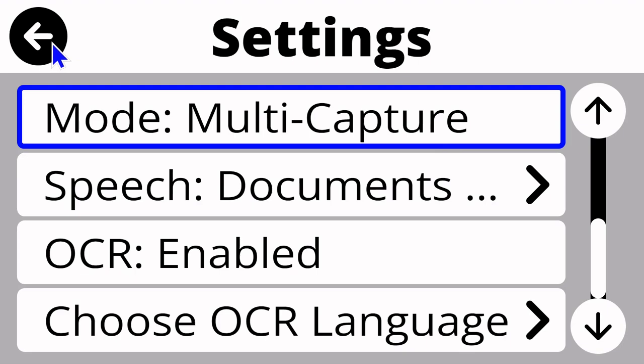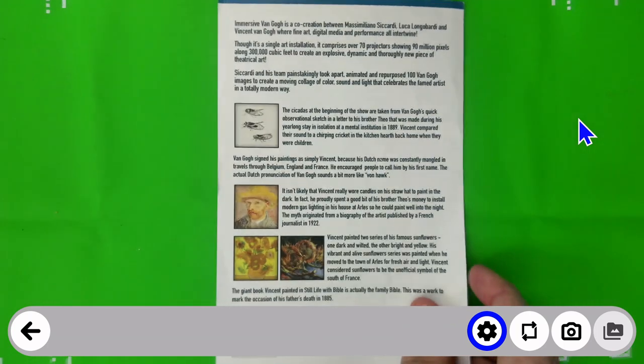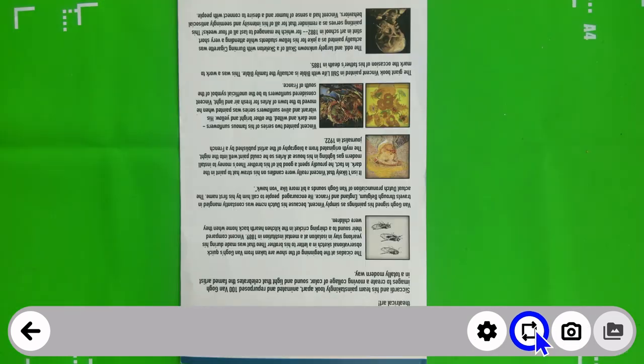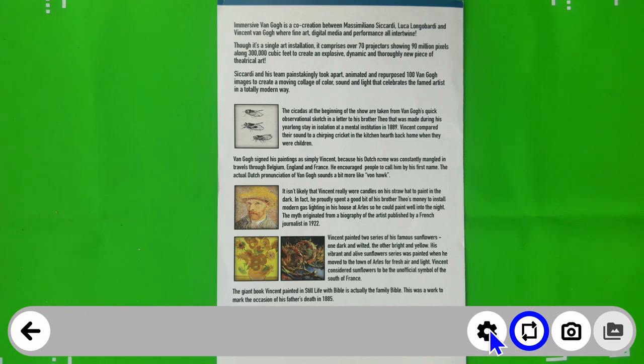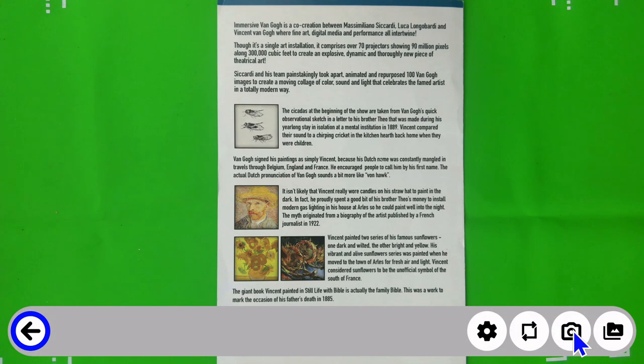So now let's hit that back arrow in the upper left, return back to a live mode here. And what we will do is move that document out and we will bring in a different document here. So I'm going to place this document in here and you'll see how this functions. I will come down here. Again, we have a rotate button. We have access to the settings. We've already seen those. I'm going to click on the camera and you'll see a message saving page one.